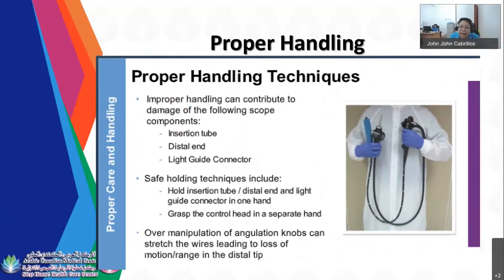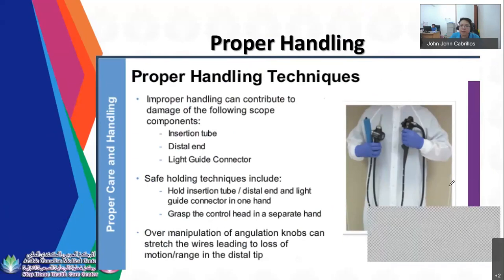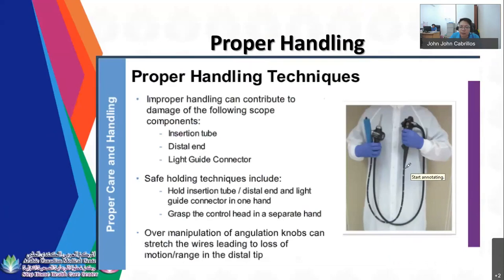So, proper handling techniques of your endoscope, guys. This is the proper way to hold your endoscope, especially when you are removing the endoscope from the transport bin because you need to clean it. That's the proper way of handling the endoscope, because you are not allowed to bend or kink the inner channels or the outer channels, because it can damage the inner channels. For this part, you are not allowed to kink or bend it. That's the reason for the proper handling of your endoscope.